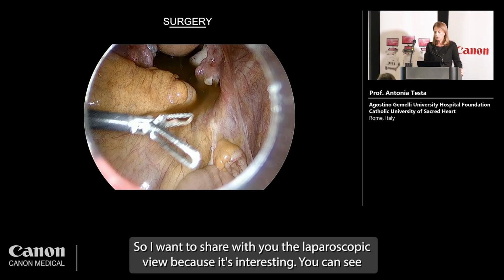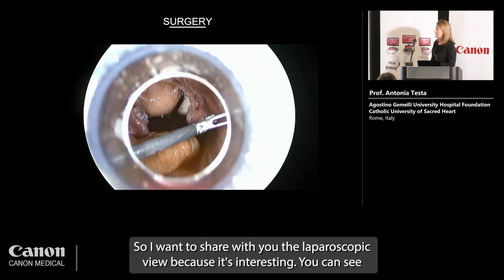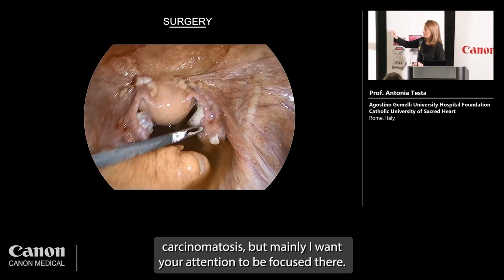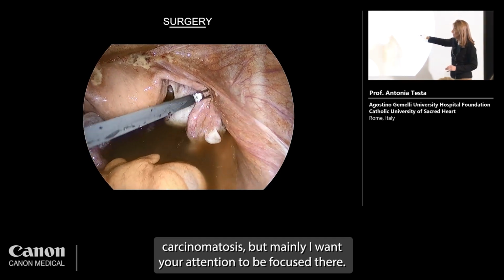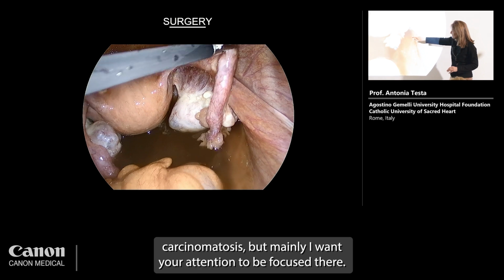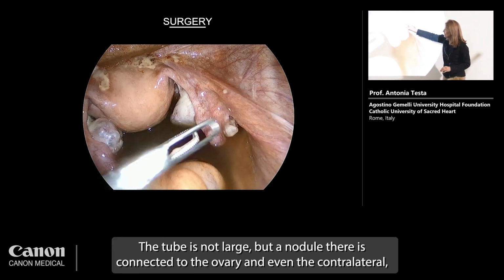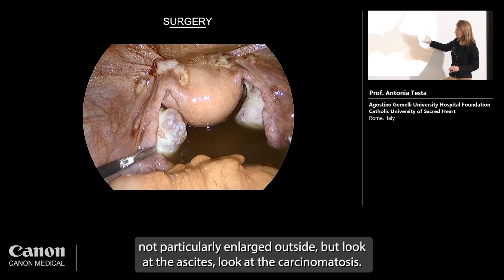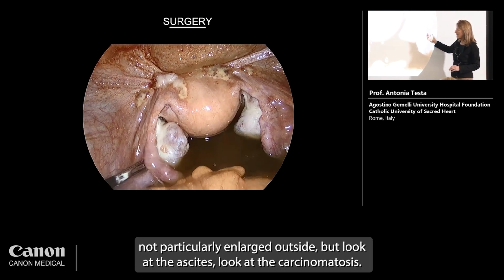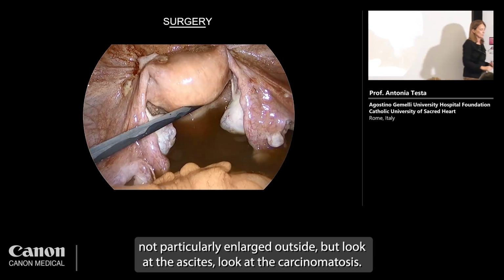So I want to share with you the laparoscopic view because it's interesting. You can see carcinomatosis, but mainly I want your attention to be focused there. The tube, not enlarged, but a nodule there, connected to the ovary. And even the contralateral, not particularly enlarged outside, but look at the ascites, look at the carcinomatosis.